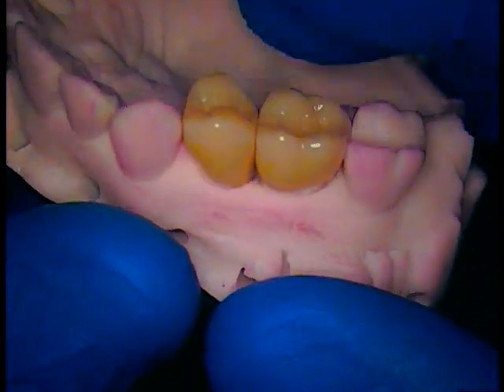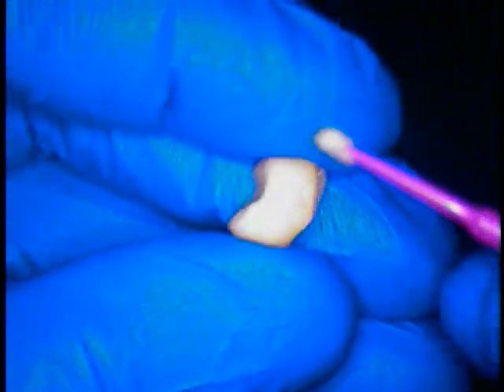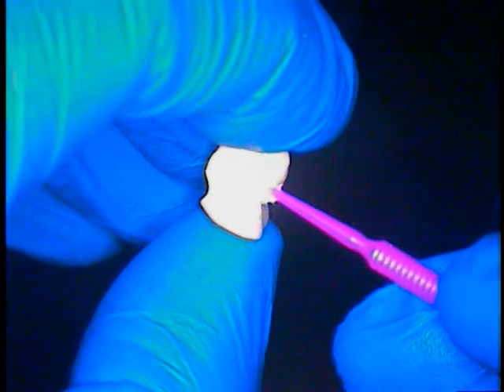That's the cementation process. We're going to move to the mouth now, but before we do that, we're going to put a little Vaseline on the contact area only — not on the margin, just on the contact — to allow us to floss through and disallow any cement from grabbing and hanging on to contact areas. We don't want any cement caught in those areas.